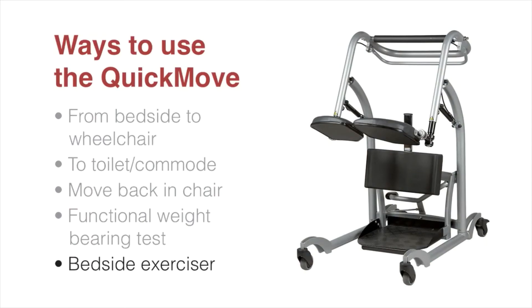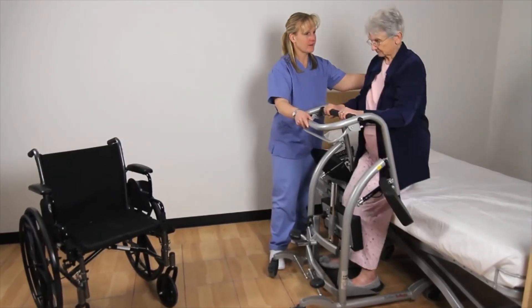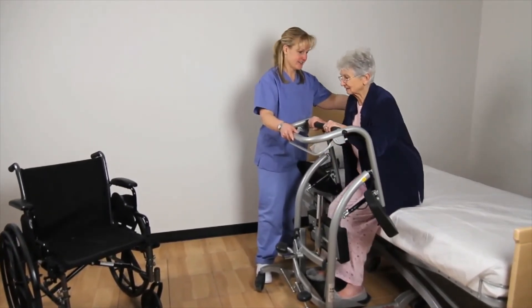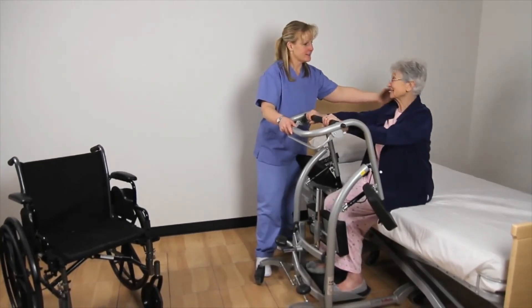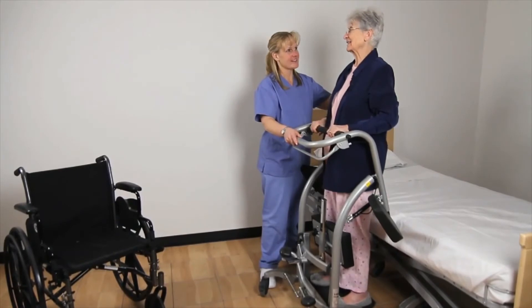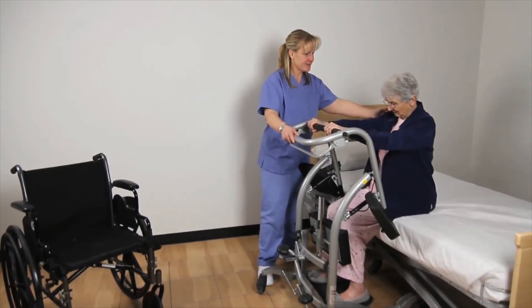The last way to use the Quick Move is as a bedside exerciser. To save time, use the Quick Move as a mobile exercise unit by the bed or wheelchair — the patient can stand and sit from either the bedside or wheelchair. If the patient performs this exercise well, the bed can be lowered to make the standing exercise more difficult.